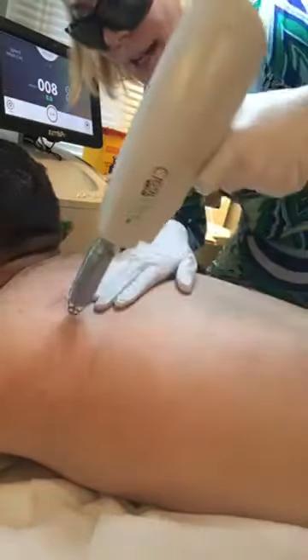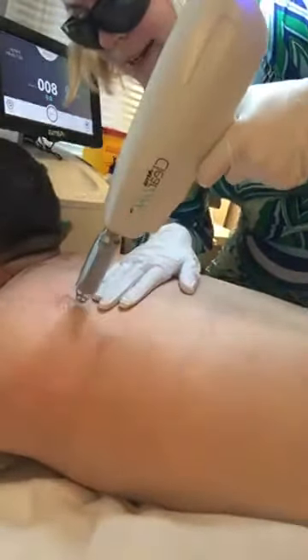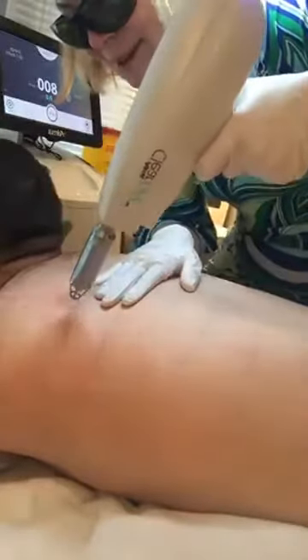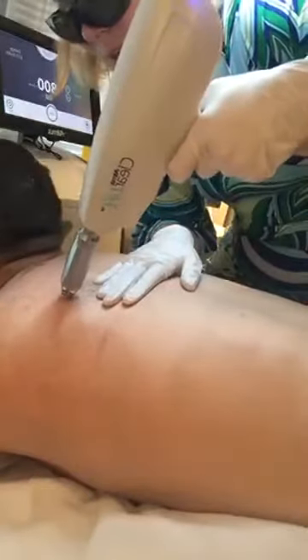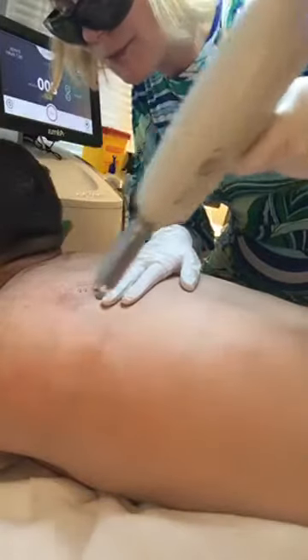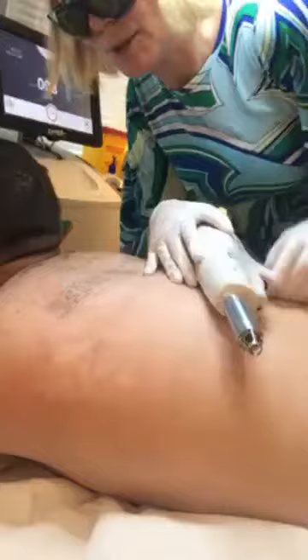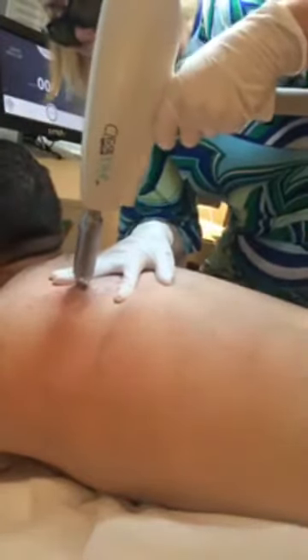How are you doing there, Mike? Are you comfortable? Freezing cream is your friend. How do you find it compared to last time? Oh, a million times better — better living through chemistry! So that's one letter already done. Second pass all the way around — I'm just going in and filling the little areas I missed. For those watching on Facebook, you can see this little letter S has been nicely whited out and things are considerably lighter than when I saw him last time.